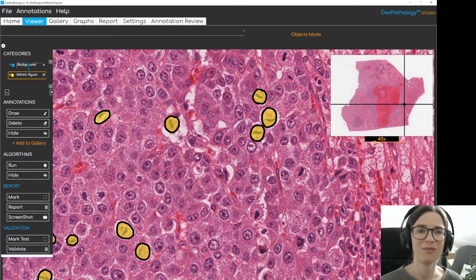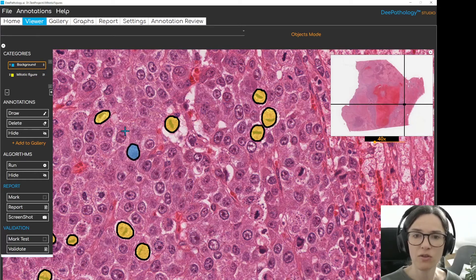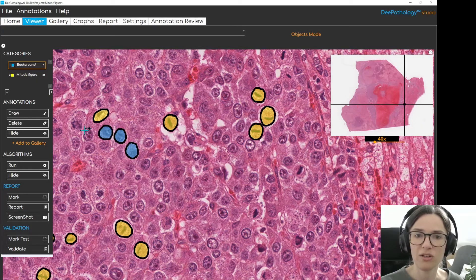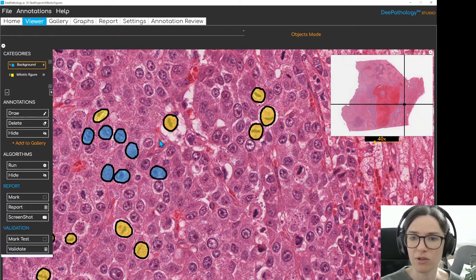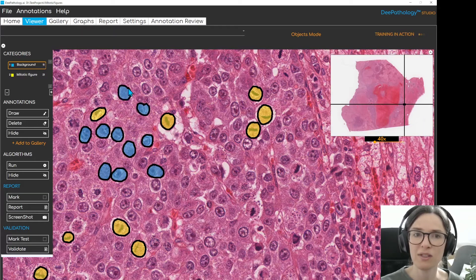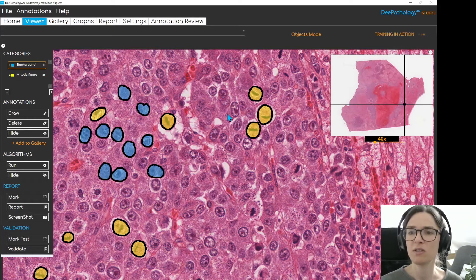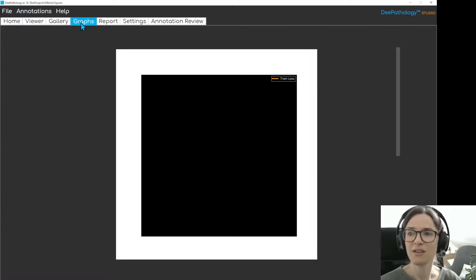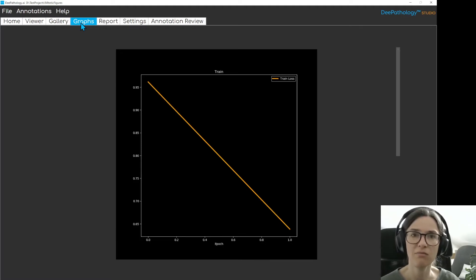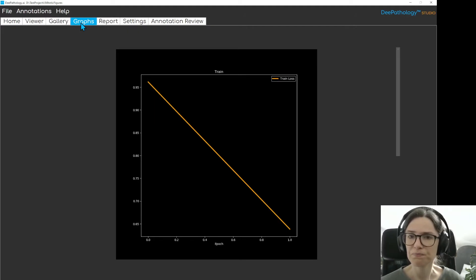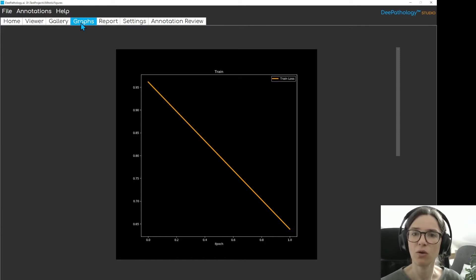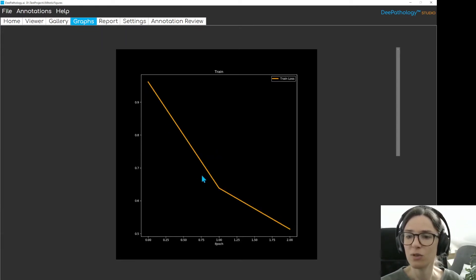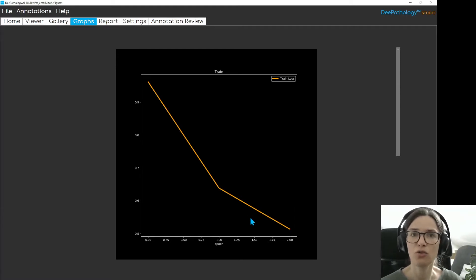I've now marked over 20 mitotic figures and I will move on to giving some information about the background — all objects within this slide that I'm not interested in. Mostly these are regular nuclei and maybe some stroma around, so you don't have to be super precise, but you have to give a few examples. As soon as you've given enough examples, the algorithm will start training in the background. We can go to graphs and see the train loss. Train loss is not a percentage measure like accuracy or specificity; it's essentially a sum of all errors. In the beginning it is quite high, almost one, and it will quickly go down as the algorithm adapts to our examples.